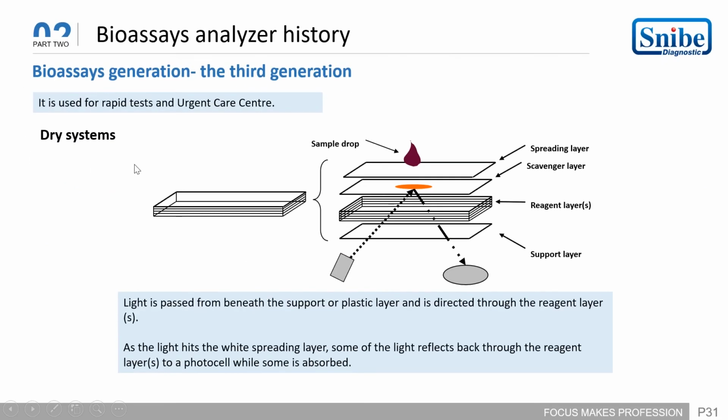And dry systems are used for rapid tests and urgent care centers.